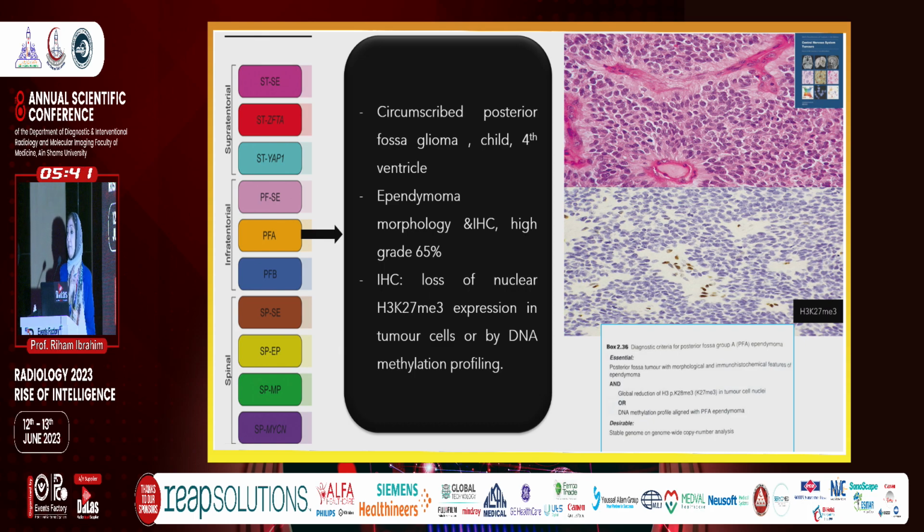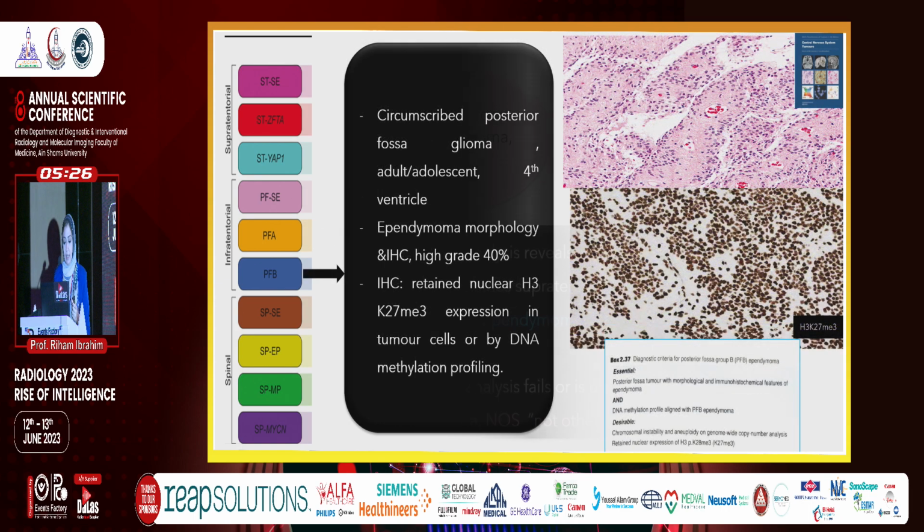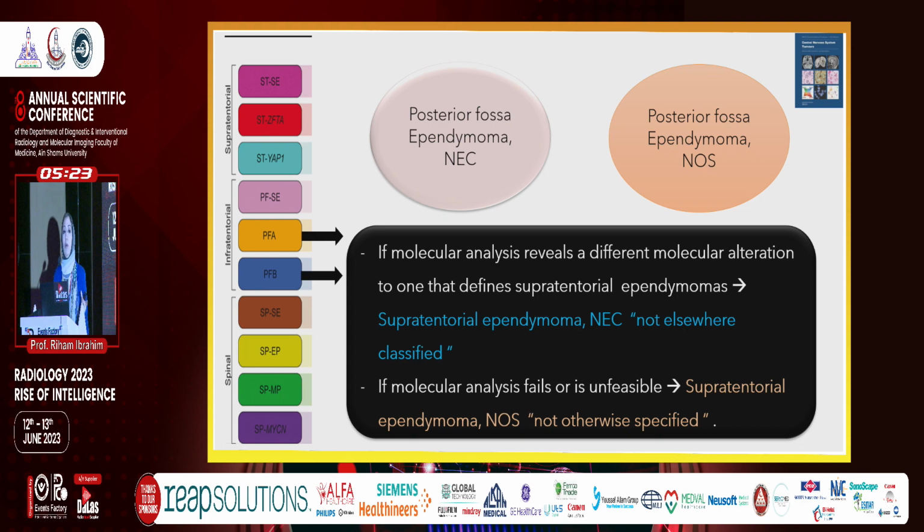The surprise here for the posterior fossa is that actually if I do the molecular, the methylation for the histone, it's only positive in 4% of cases. So here the immuno matters for the posterior fossa tumor. And this is good. This is the posterior fossa group. Again, I can always say it is NOS if I did not do the test.